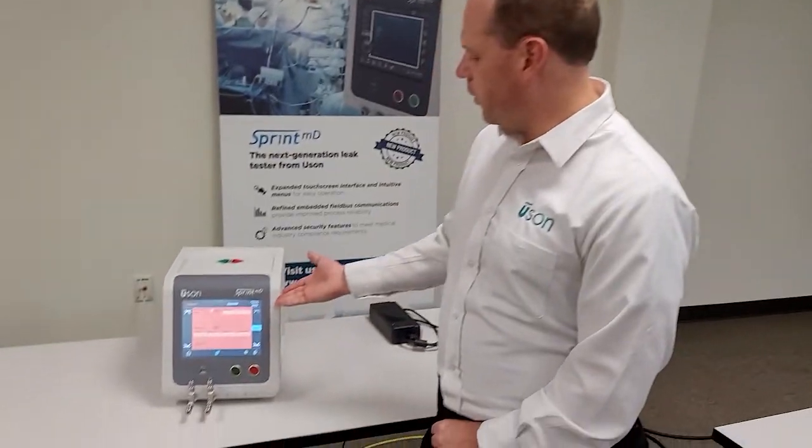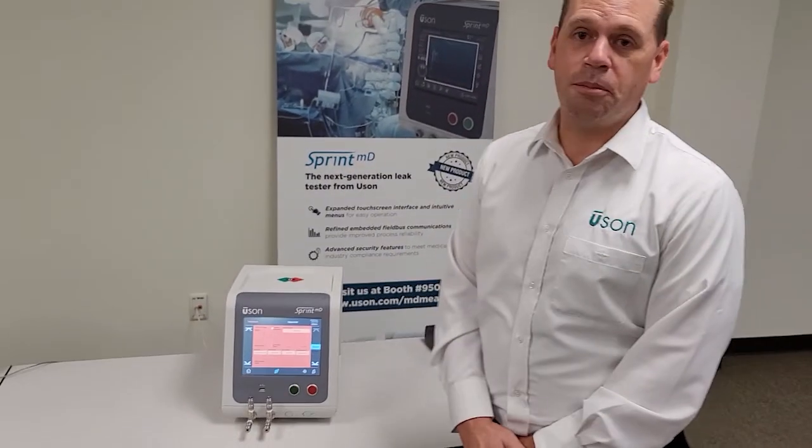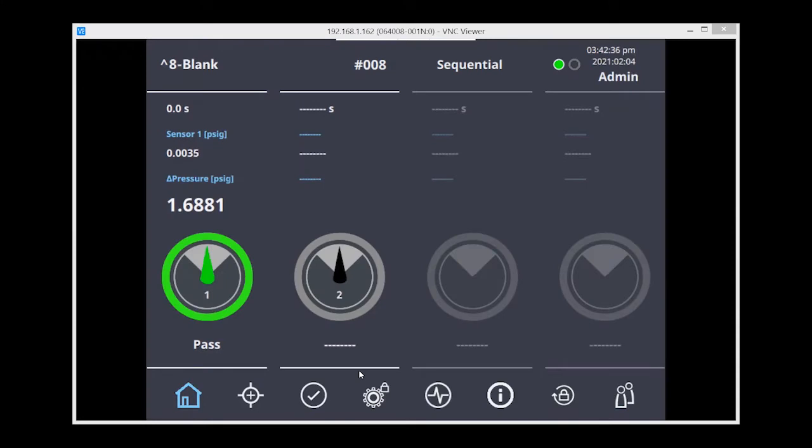I'm Jonathan Cole, the Director of Global Sales, and we have a demonstration today on the Sprint MD. I'm going to show you how to set up the occlusion test on the Sprint MD.